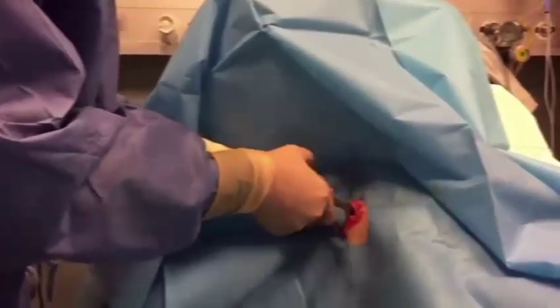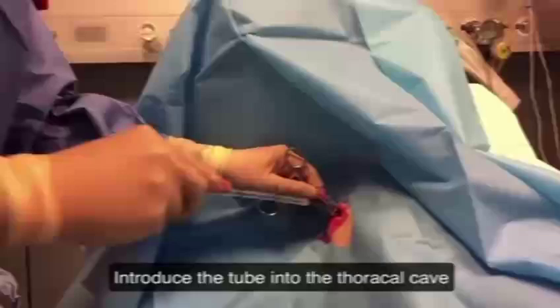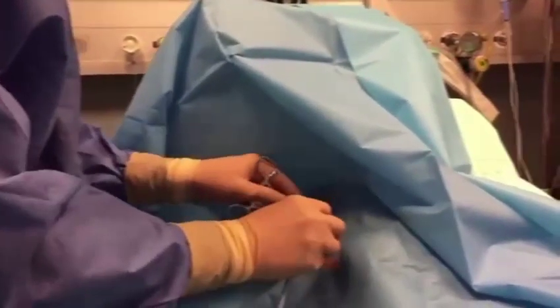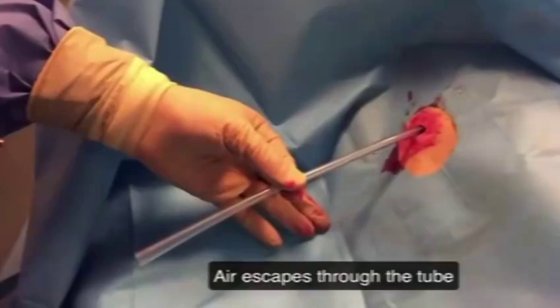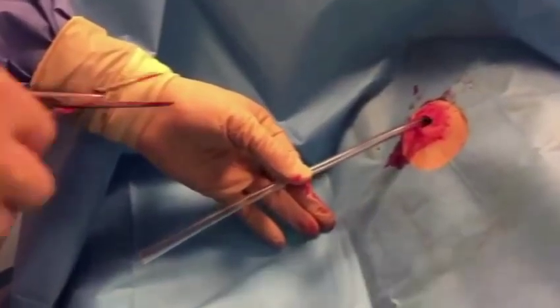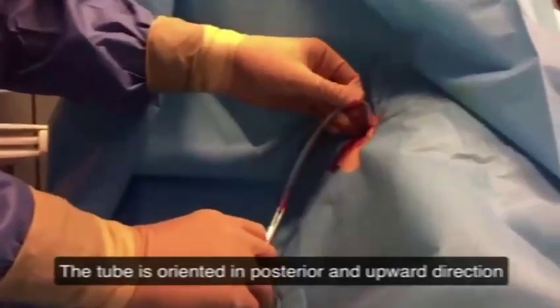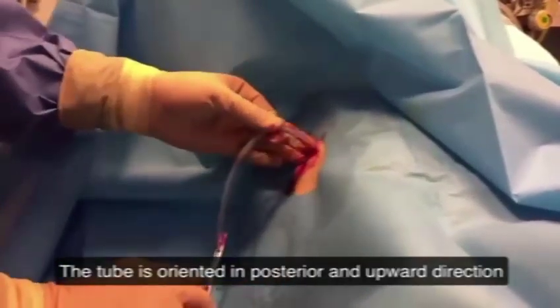Now widen the intercostal wound using your index finger. Introduce the tube in the thoracic cavity. You can see and hear air escaping through the tube. The tube is oriented in posterior and upward direction.